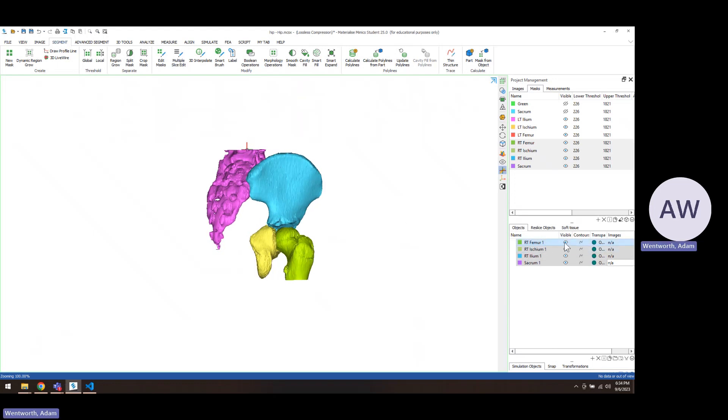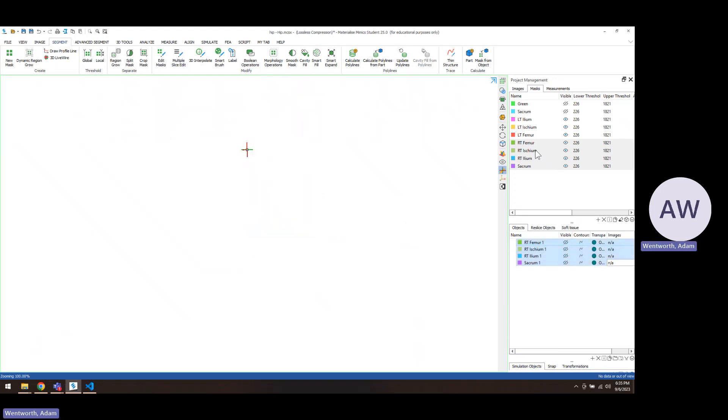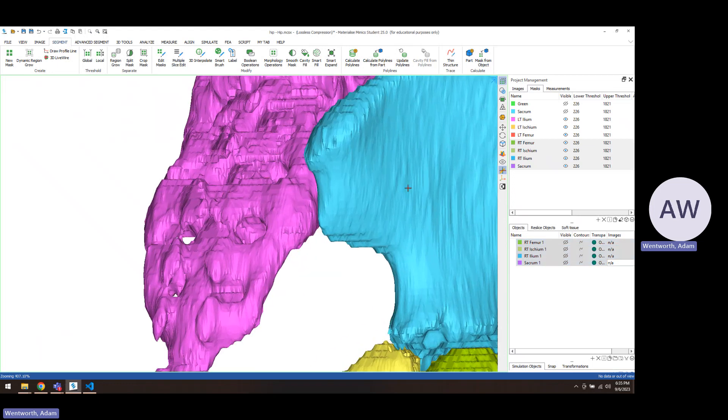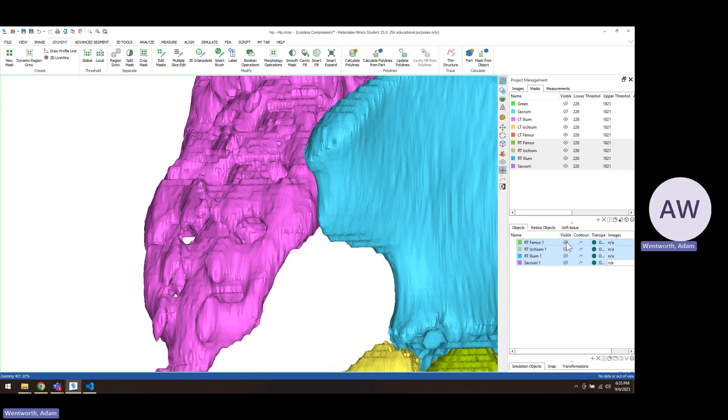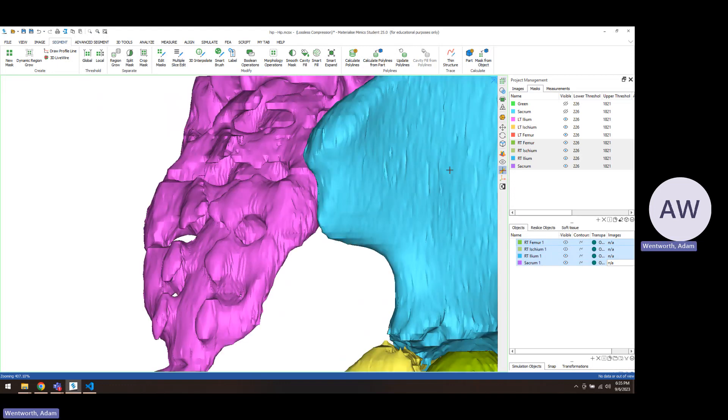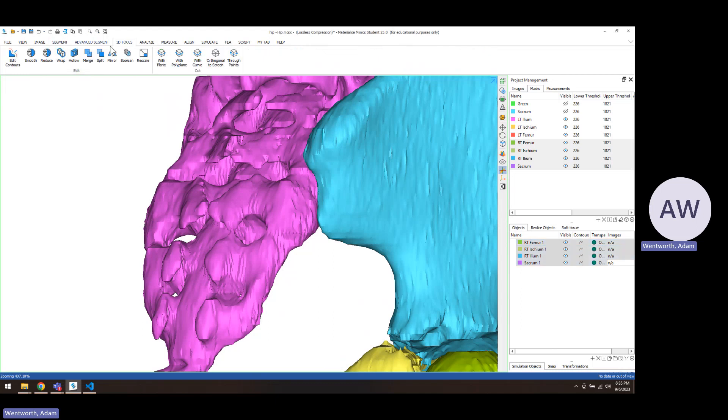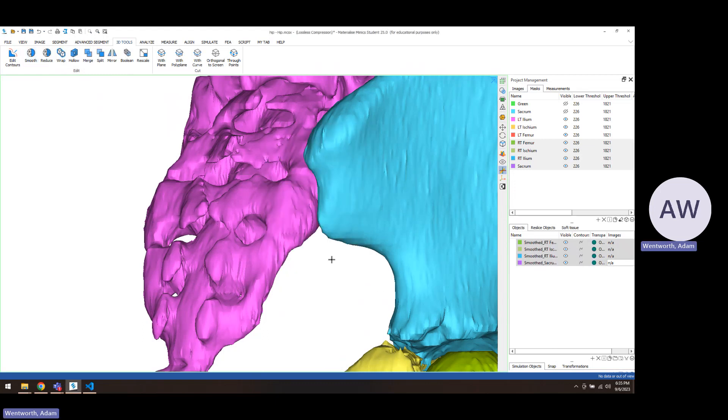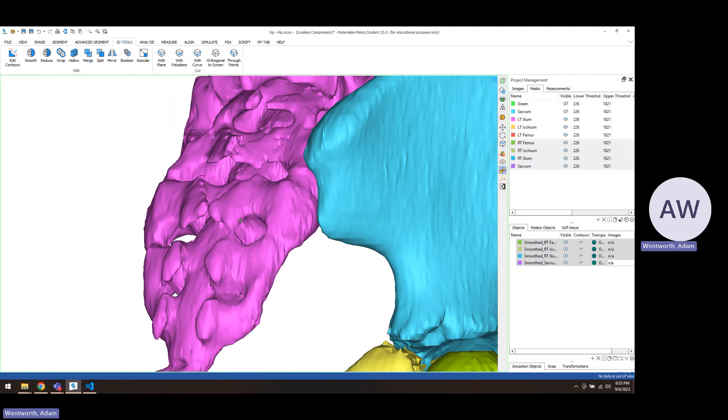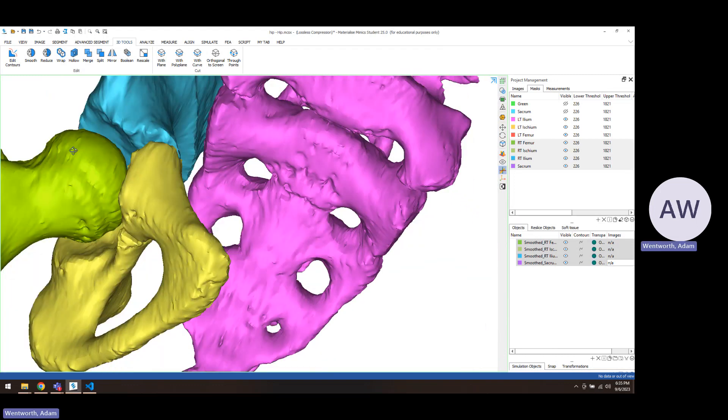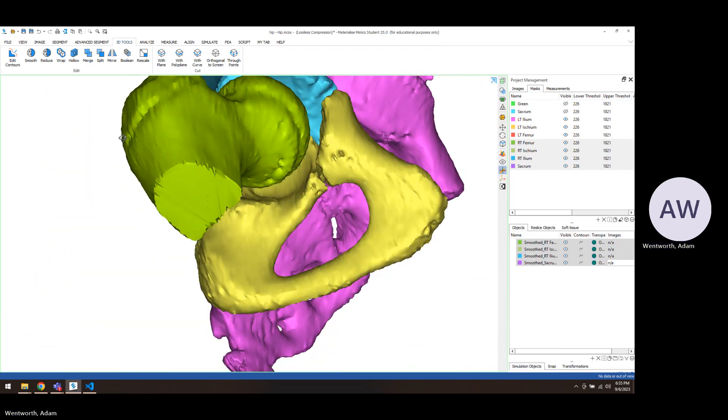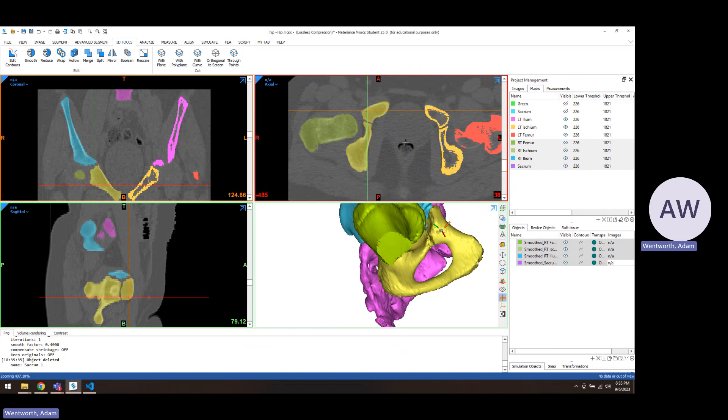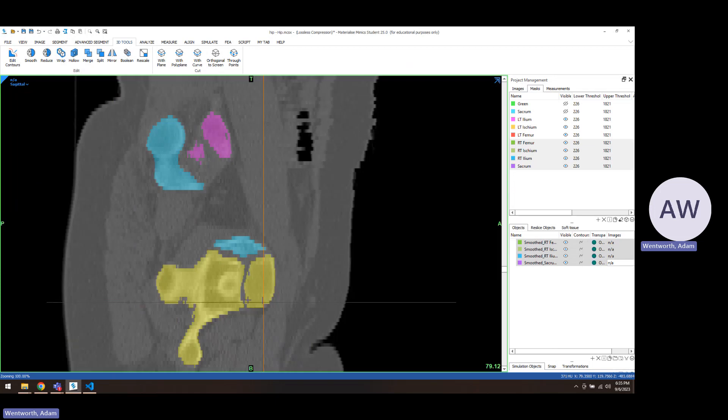Versus if I turn those off and show you the 3D masks. Those are made of voxels or three dimensional pixels. Kind of like the marked pixel through a slice. You see there's a slight difference to them. We also do smoothing operations after these as well. So if you did 3D tools and a smooth function, it goes from zero to one. And you could do a slight amount. So that's slightly smoothed. So that might be something that's common. And you can look in the parts after and see like there's a hole right there. So easy to spot. You can click it in the 3D and then you can go back and you might be able to see it in the images and fix it later.